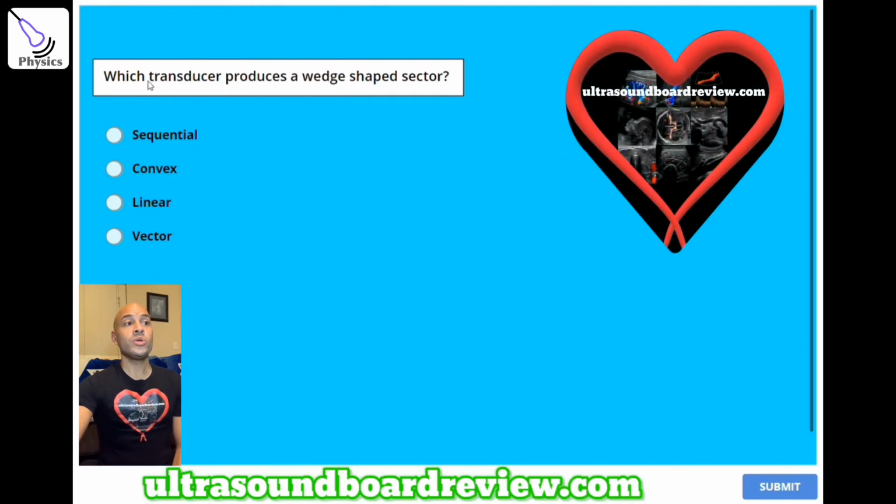Question number 5. Which transducer produces a wedge-shaped sector? A. Sequential. B. Convex. C. Linear. Or D. Vector. The answer is D. Vector.